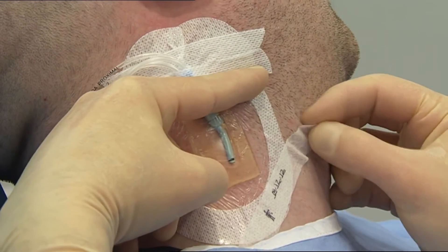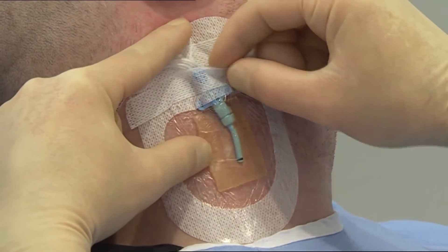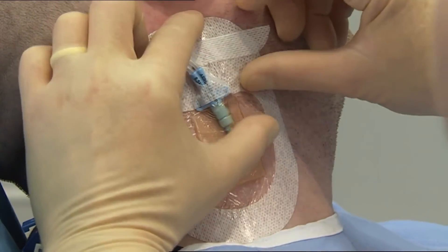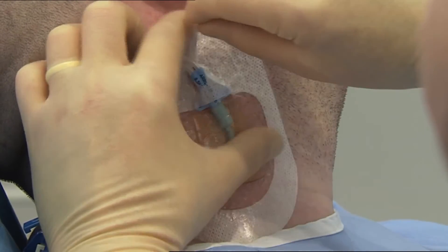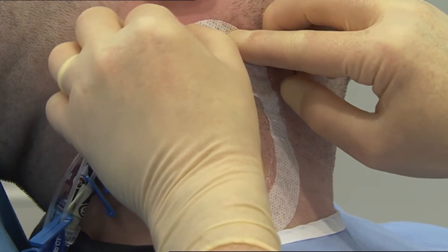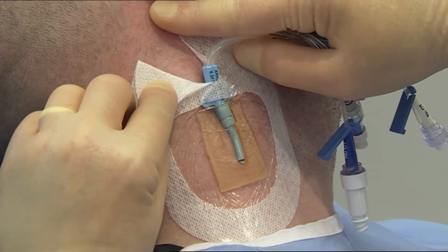Remove the date record label from the dressing. Next, remove the tape strips used to secure the lumen.